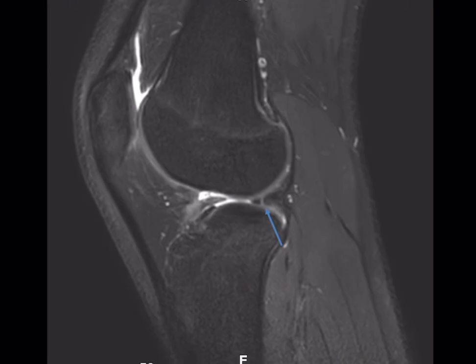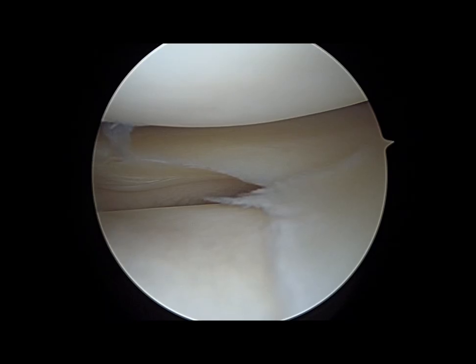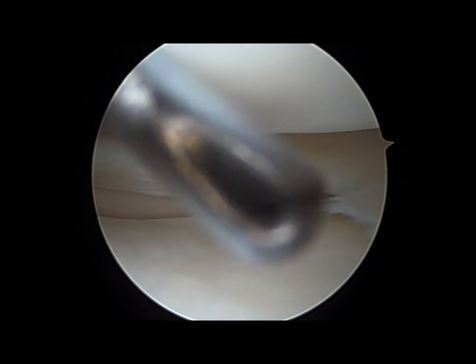Since we know that MRI only has a 69% sensitivity and 88% specificity of diagnosing an arthroscopically confirmed posterior lateral meniscal root tear, it is important to have a thorough systematic arthroscopic evaluation of the posterior root of the lateral meniscus during an ACL reconstruction.